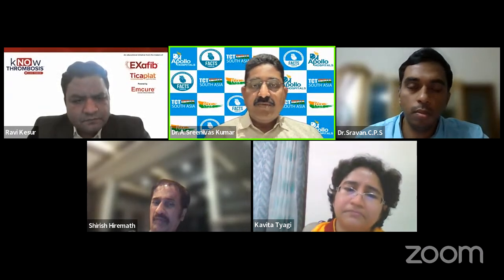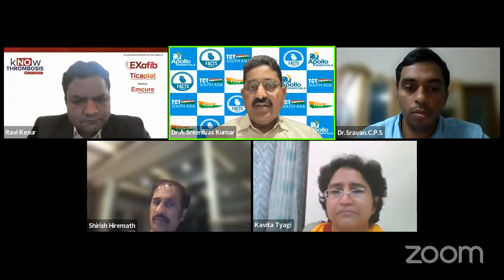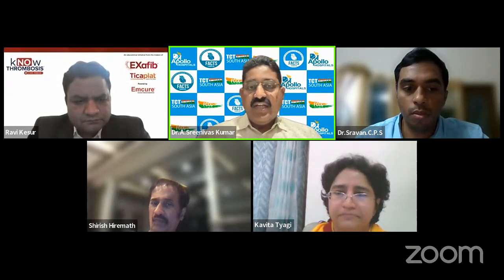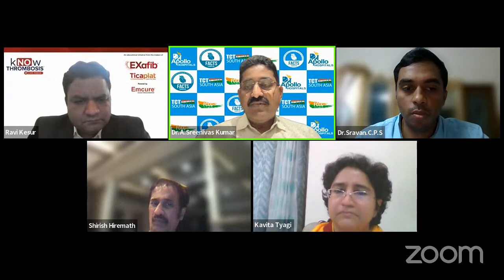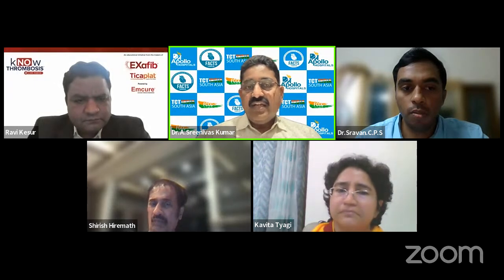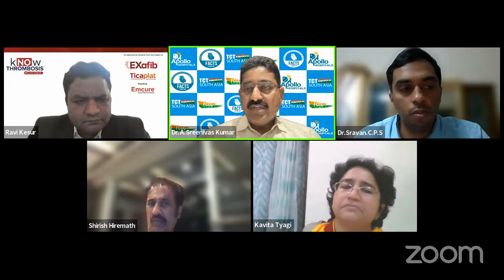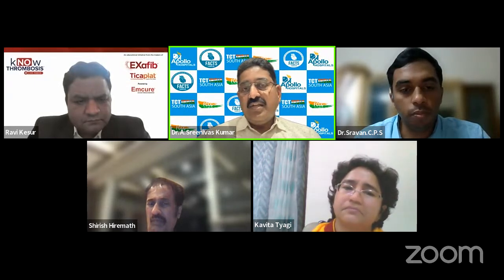So that is also, people are saying after OCT, this path is followed. But I feel even if something is there, if you are not able to do OCT, if angiographically it is totally looking normal, flow is fine, in fact even if angiographically there's pinching, if you do FFR it comes negative because most of the time it is plaque shift. So unless it is essential, generally we avoid doing kissings. But sometimes the flow is compromised, and then you have no choice.